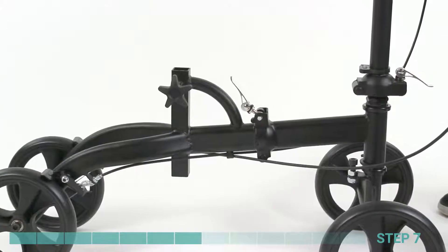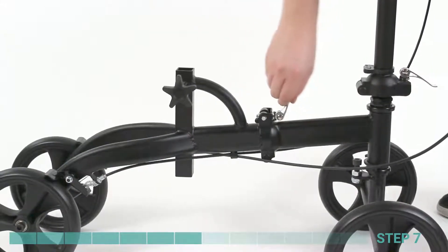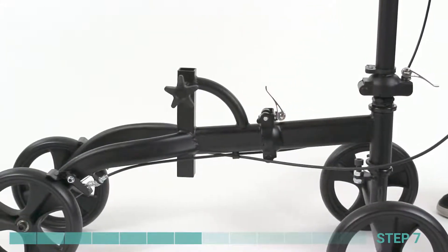Step 7. Repeat Step 6 with the tension lever at the folding joint between the front and rear axles.